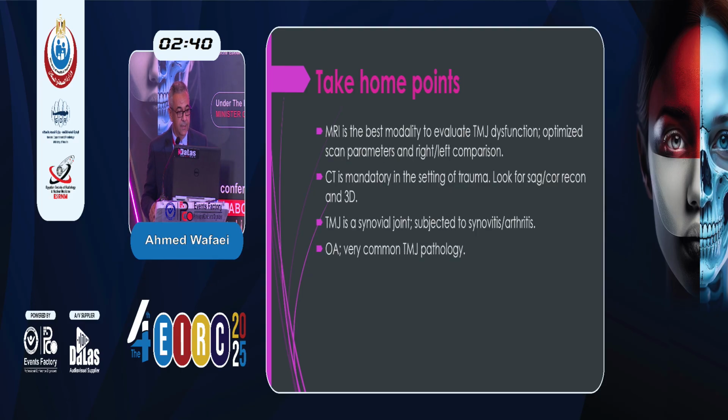Our take-home points are: MRI is the best modality to evaluate TMJ dysfunction. Optimized scan parameters and right-to-left comparison are very important to consolidate our confidence in diagnosis. CT is the modality of choice in the setting of trauma and fractures. Please look at sagittal and coronal reconstructions and 3D in order not to miss a minor non-displaced fracture.